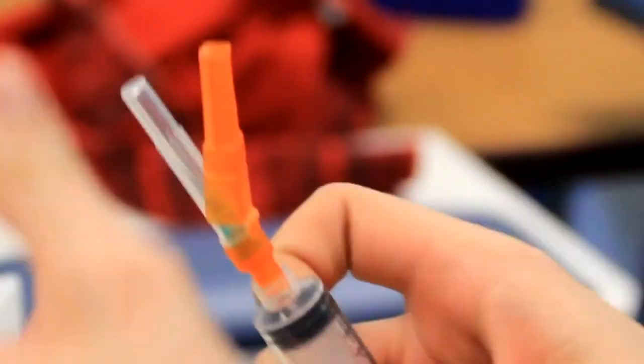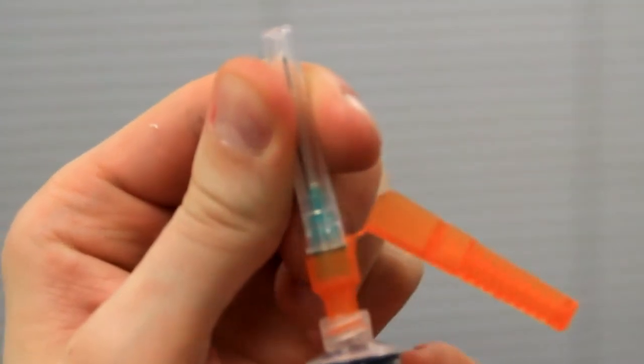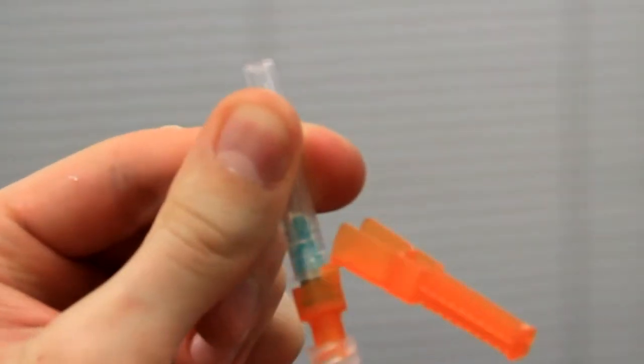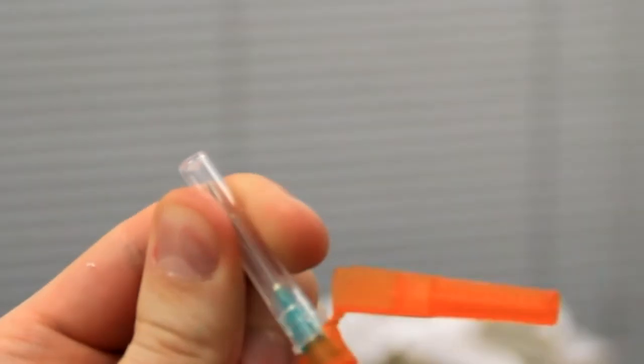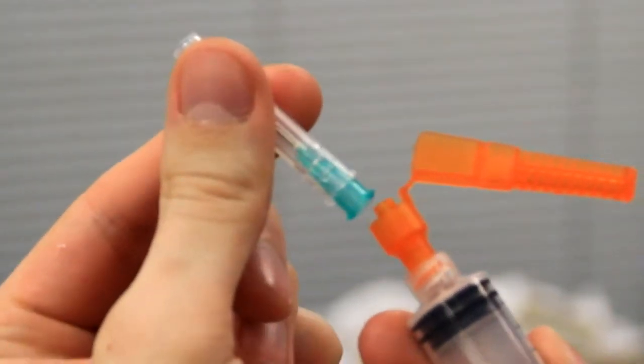Depending on the needle chosen, it can have either a luer slip or a luer lock. If your needle has a luer slip, simply spin the needle on the hub until the safety device will be out of the way with the bevel facing up.